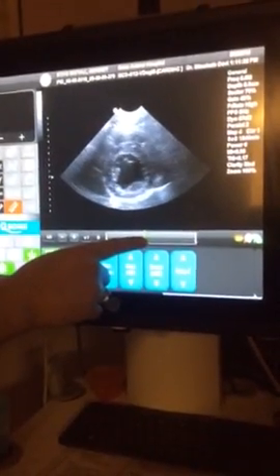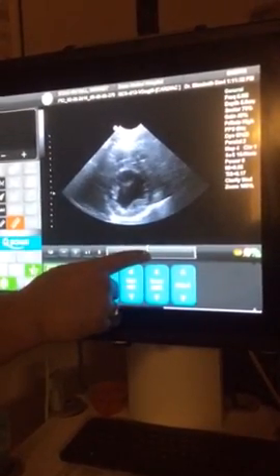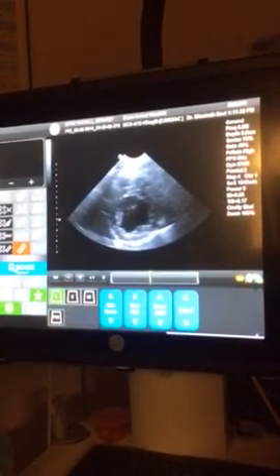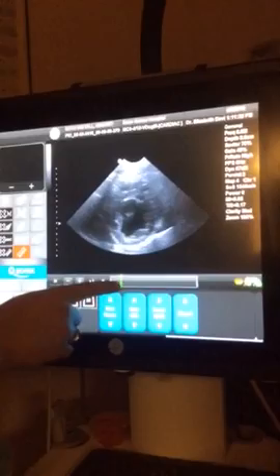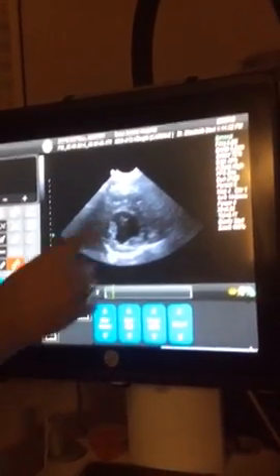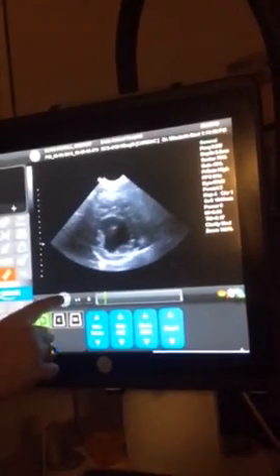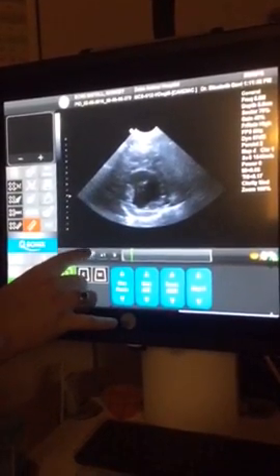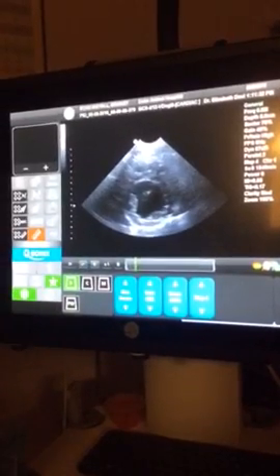Now what you do is you use your green scroll bar and you pull about halfway back through the image. Okay, so you want to find diastole first. So we want to find our most open mushroom first. Okay, once we kind of find that, let's see if I can get one where the wall is a little better. Okay, once you're about to that point, you can use the plus or minus sign just to kind of micro move it to where you're in your most diastole opening.